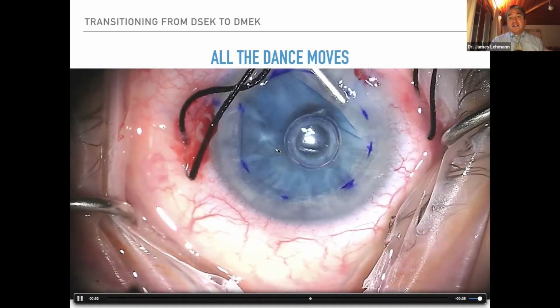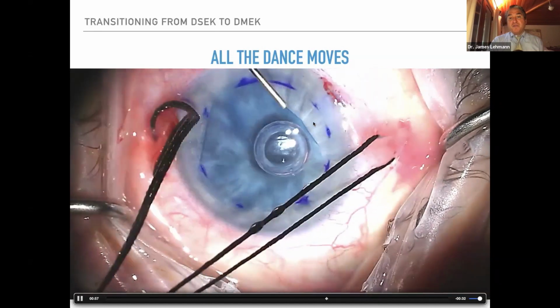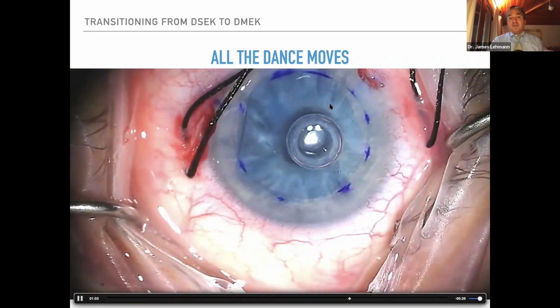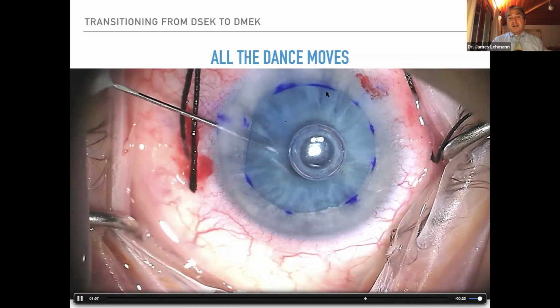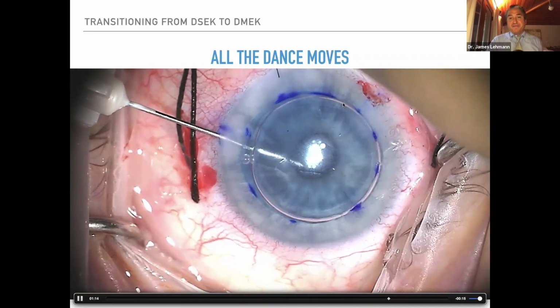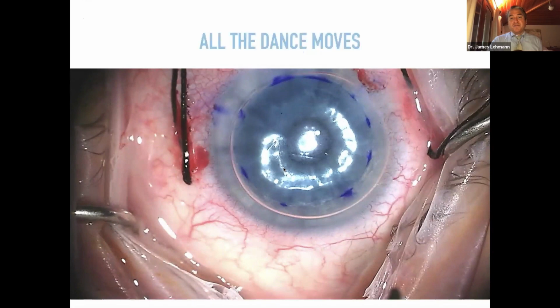And then kind of same thing on this side. But I got to rotate the eye now because I need the bubble to help. So point lock fold, rotate the eye, touch the tip of the point right there, and there it's unfolded. Now some golf swings to get it centered, and I like that. And then I'm going to augment my original bubble. That's 2 bubbles. That's not quite as pretty, but we got it. And there we are. So those are all the steps.